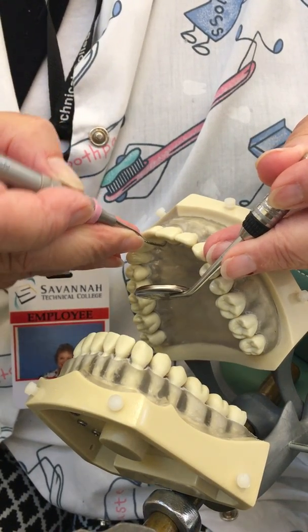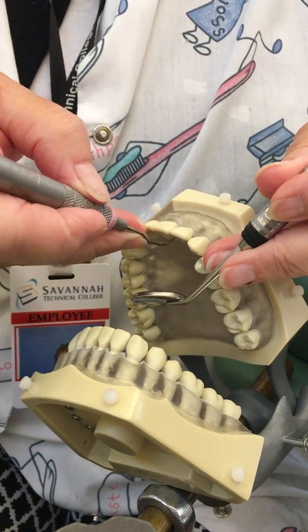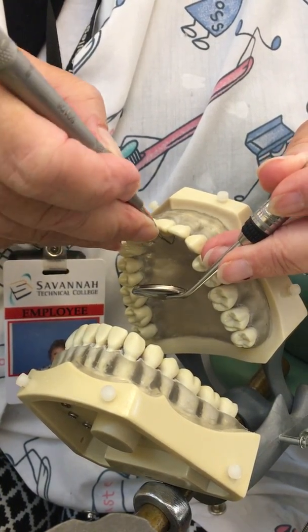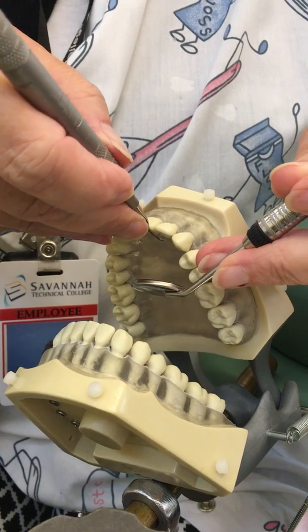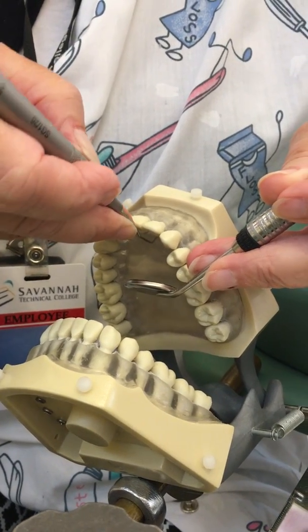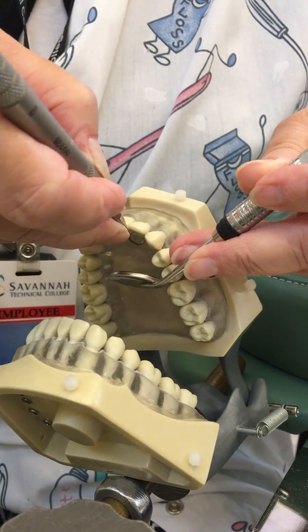Right now we are scaling at the cervical third of the tooth, but remember we would go as deep as the junctional epithelium would allow. Also, if there's anything on the crown or around the line angles on the crown, we go for that too.